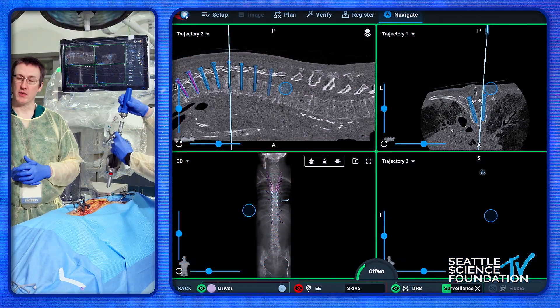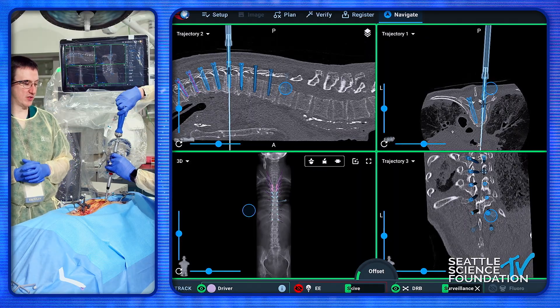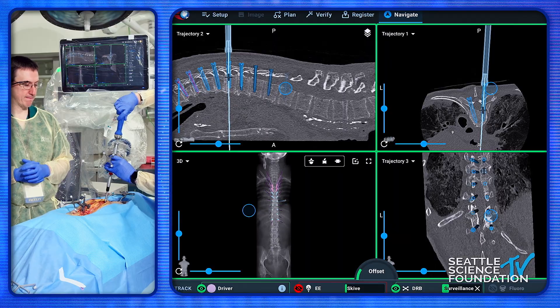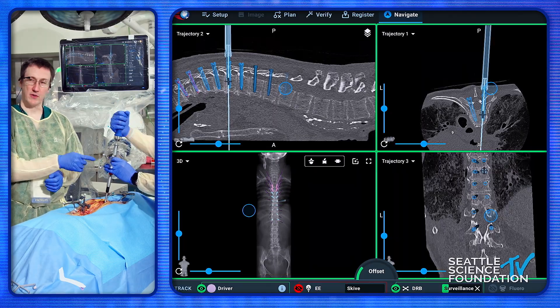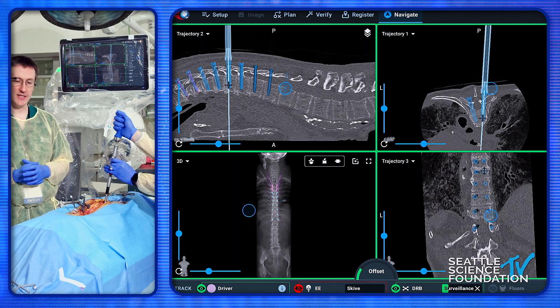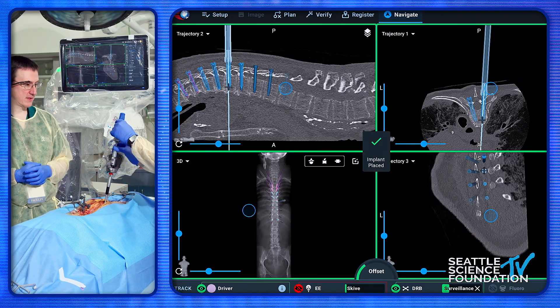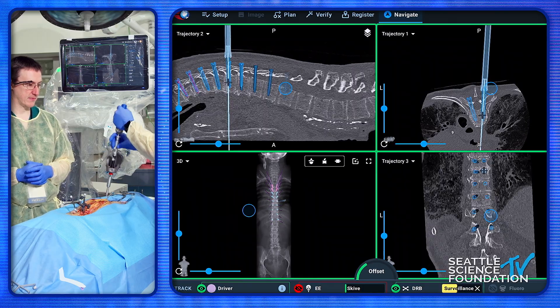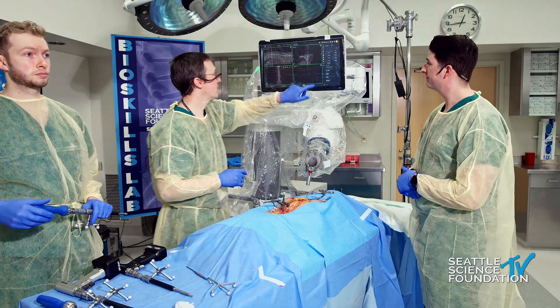Once this screw is placed I'm going to show you how we'd invert the arm on those cases that we need to. When we invert the arm, the position of the end effector is going to be different, and so the camera will frequently need to be moved to a different trajectory in order to see it — we may need to move the camera over to the other side. Before we move the camera, I'll go to this one here.